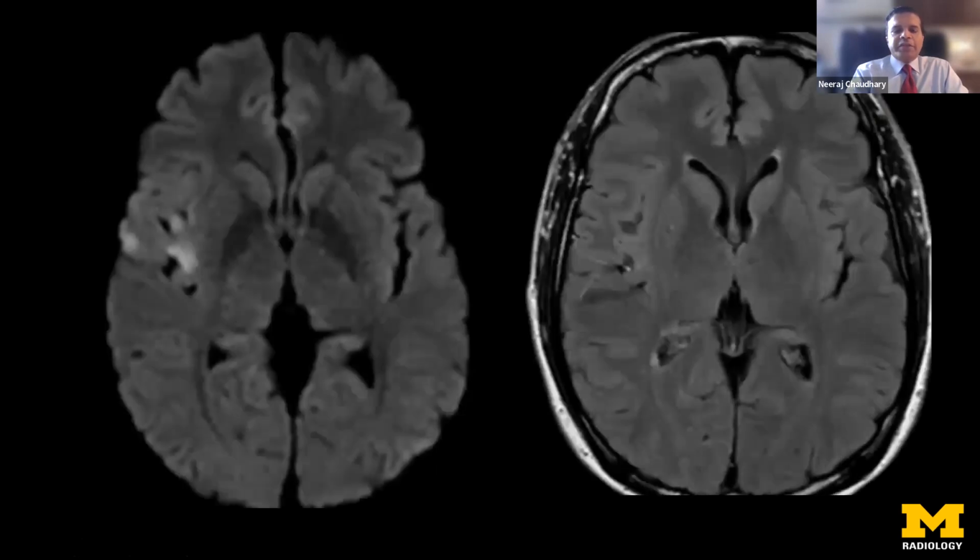What we do with CT perfusion, we can do with MRI with FLAIR and diffusion mismatch. This is a FLAIR sequence on the right side of the screen. Left side is the diffusion weighted image. We see these areas of brightness, but we don't see a corresponding area of brightness on FLAIR. That is suggestive that if you recanalize vessels or improve perfusion in this part of the brain, these diffusion bright areas will resolve. They are salvageable. There is this understanding in texts that once you get restricted diffusion on MRI, that tissue is not salvageable. I think that is false.